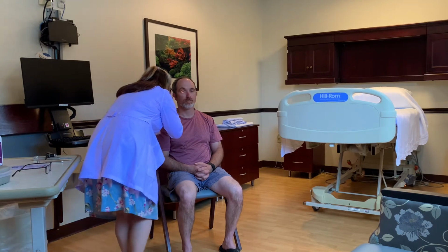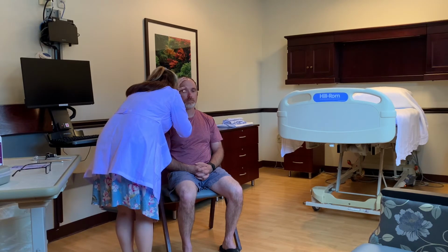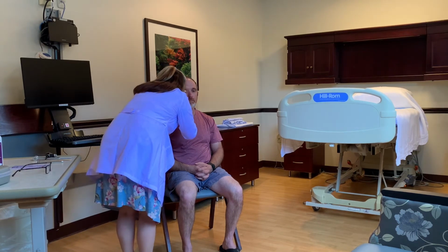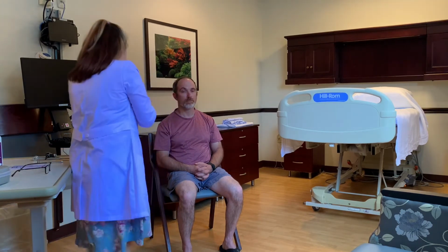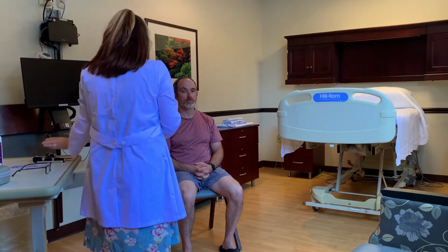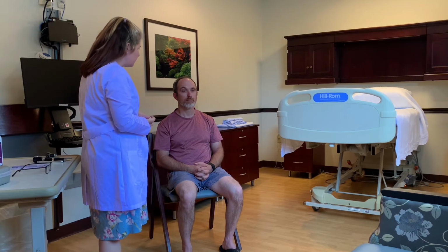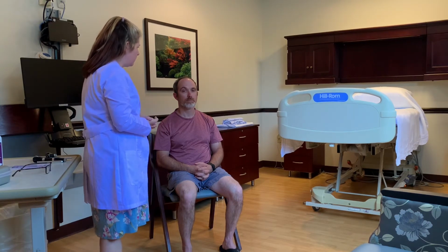And then I'm going to move in really close, and I'm going to look at the patient's optic disc and the physiologic cup, looking for color, and then I'm going to have you look straight at me. Okay, good. So there's no AV nicking, no exudates, no hemorrhages. I'm looking at the fovea and the macula, and no papilledema.